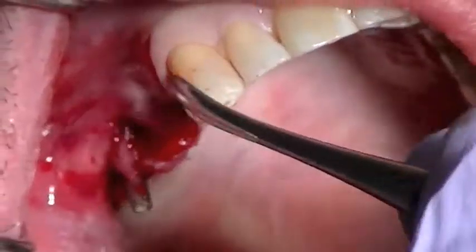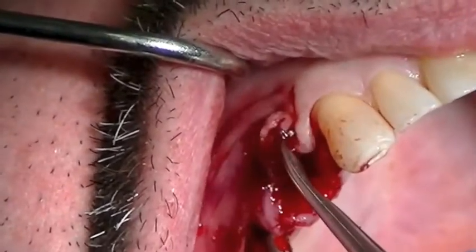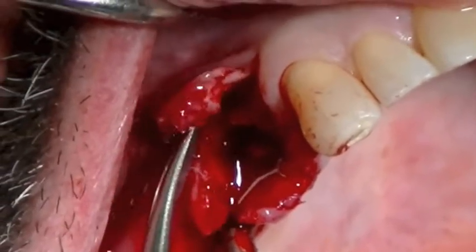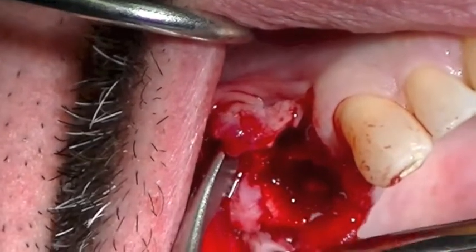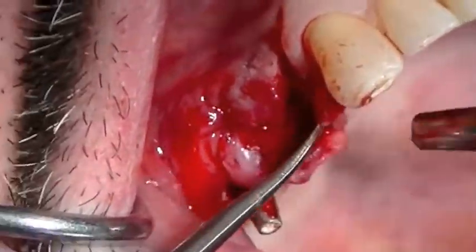So we're just going to very gingerly elevate the tissue — the attached tissue — from the socket site. What I want to show is not only the socket, which is truly a four-wall defect, but we also have a significant facial defect that I want to correct with my grafting materials. We're elevating gingerly on the facial, but we also have to elevate the palatal surface.